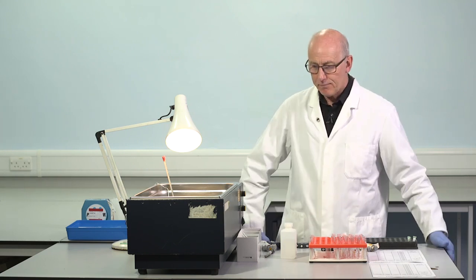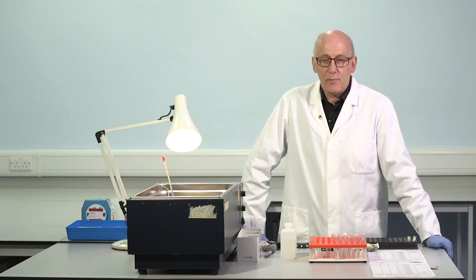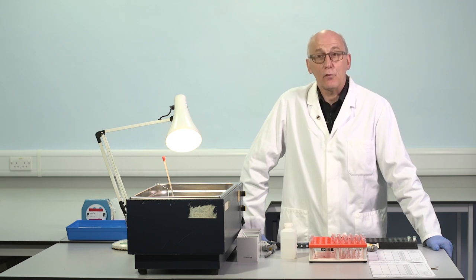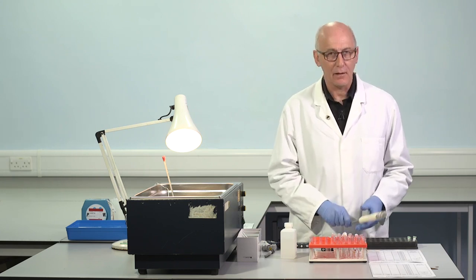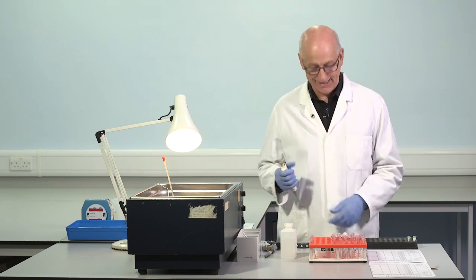In congenital patients, there is in most cases good agreement, but it's very clear that there can be big differences between the inhibitor titers if we use chromogenic assays in patients with acquired haemophilia. So I think we need more data on this before we can make a firm conclusion about whether it's safe to use chromogenic assay in this setting.